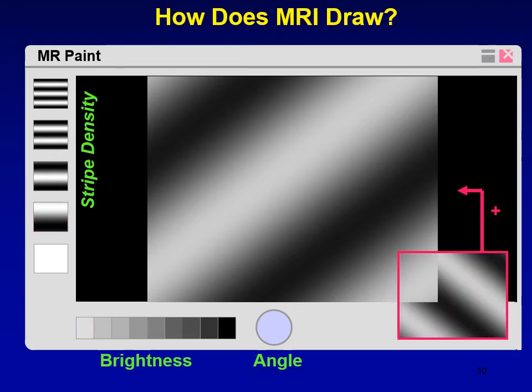Next, we add information across the whole image with a frequency pattern which is different, at a different angle, a different obliquity, and a different intensity, such that after the addition of the second batch of data, the MR image at this point would look like this.